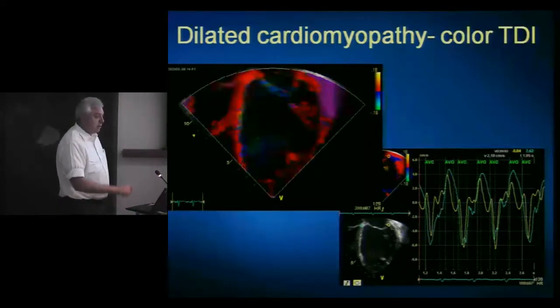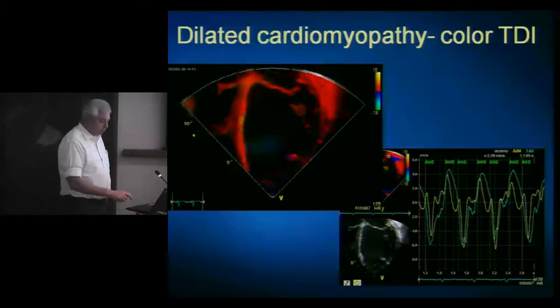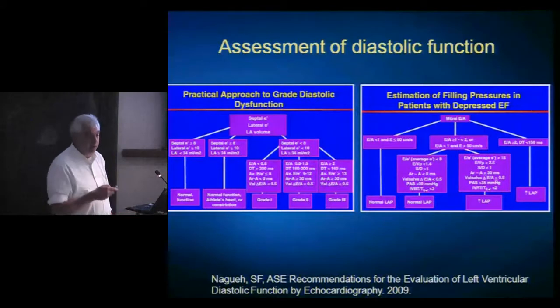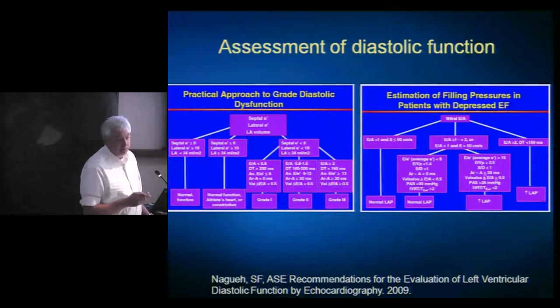And so the enlargement in itself can contribute to the heterogeneity in wall stress, and the regional dysfunction can perpetuate that in itself. Tissue Doppler has also been very helpful in adult paradigms, and this, as Norman stressed, works less well in children, and we're looking into that systematically. But in adult paradigms, it works for a number of etiologies.